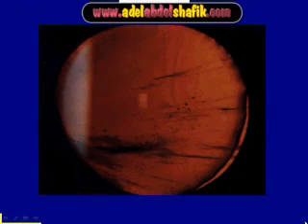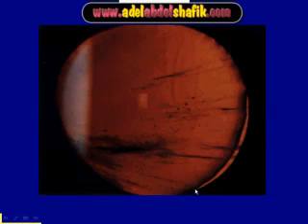You can see the continuous thread, and you can see this lower part is clear while the upper part is full of dots. This is the line of demarcation — the rejection line between the area full of KPs and the area intact with no KPs. This is seen against the red reflex, and this is retro illumination.